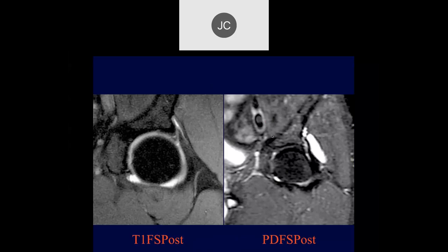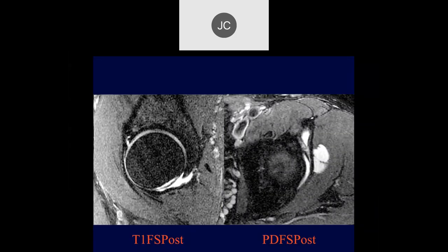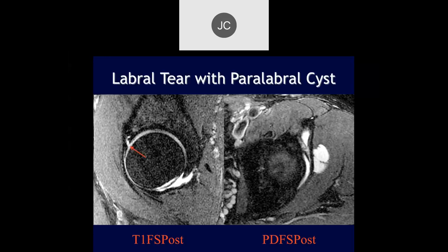Robert — looking at the superior labrum, there's irregularity on the left-sided image, and there's a paralabral cyst extending superiorly on the right. You can actually see the fluid going through the tear into the paralabral cyst, which then extends anteriorly with a large adjacent cyst. With a cyst, you can feel very comfortable that you're dealing with an actual tear.